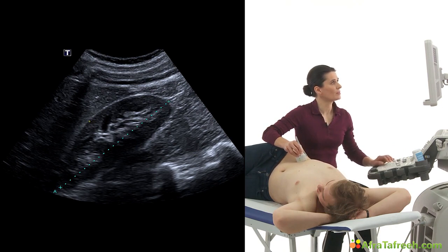And then the transverse diameter over here. Should be between 4 and 6 centimeters. It's 4.6 centimeters, so that's also perfectly normal.